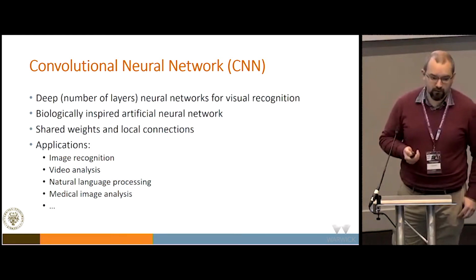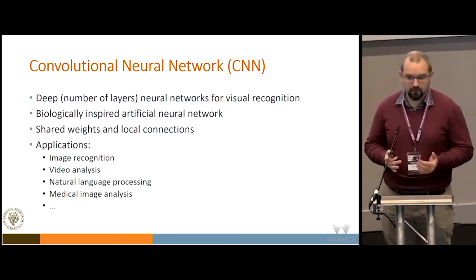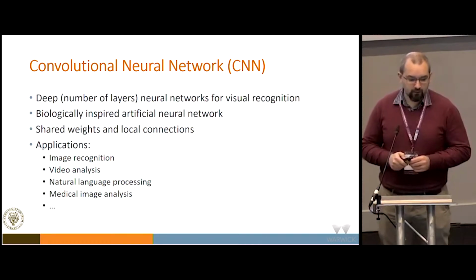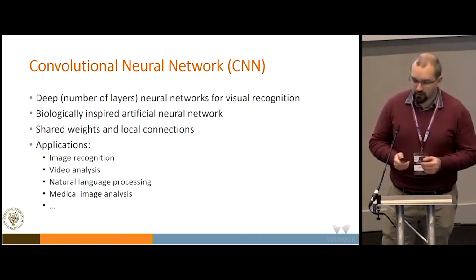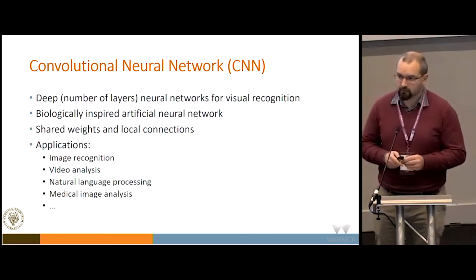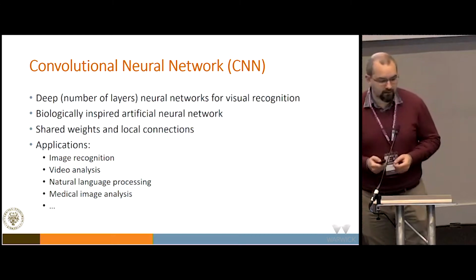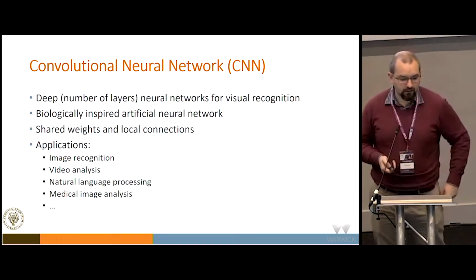So what we use to approach this problem are deep learning methods based on convolutional neural networks, which are biologically inspired neural networks, virtual networks that can apply to visual problems, like image recognition, video analysis, natural language processing, or medical image analysis, as in our case.